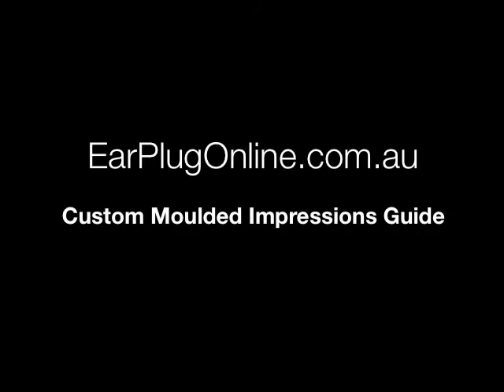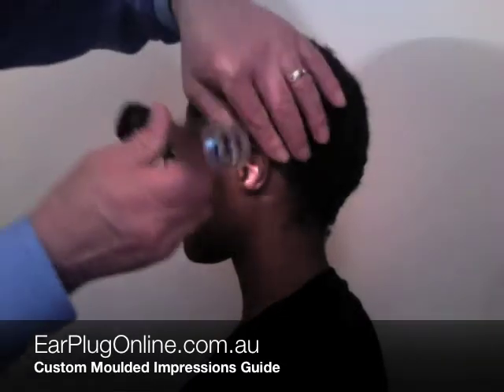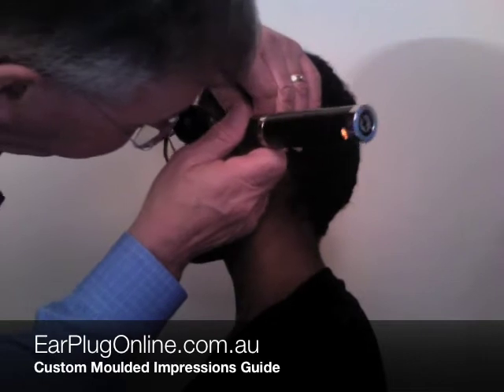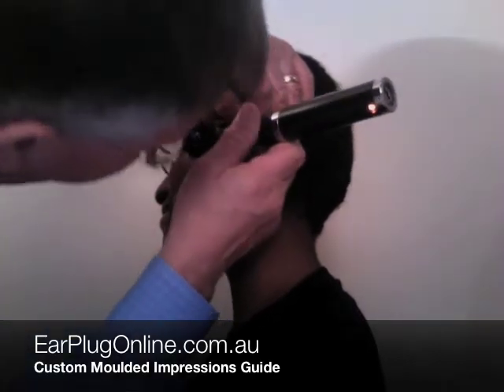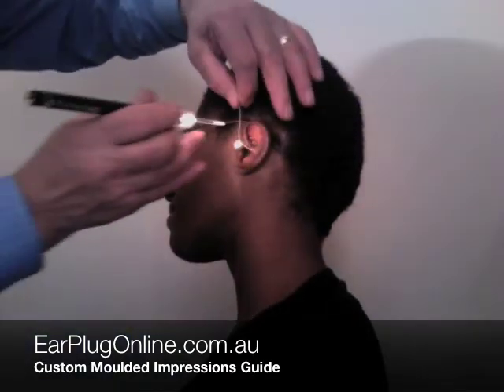This short video will show you how your custom ear impressions will be taken by your audiologist. A short examination of your ears is conducted to ensure that your ears are healthy and do not have wax build-ups or obstructions that would prevent a perfect impression from being taken.